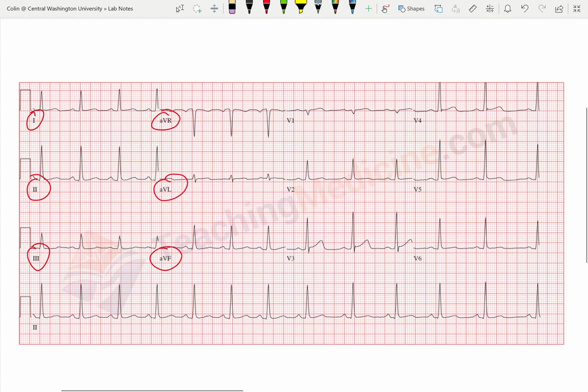And the lead that we've been talking about this whole time, even though we haven't really mentioned it, the lead that we are paying attention to and that we teach 4 and 12 lead off of is lead 2. And we're going to talk about why that is. But just for now, say, okay, lead 2 is the one that I know how to read. And you're going to see that it's really the same rules for all of them. There isn't really too much of a difference.